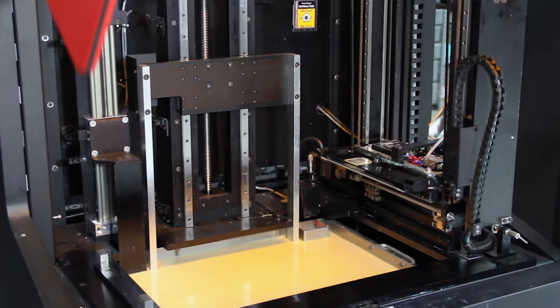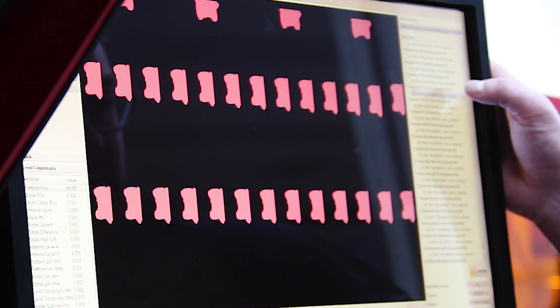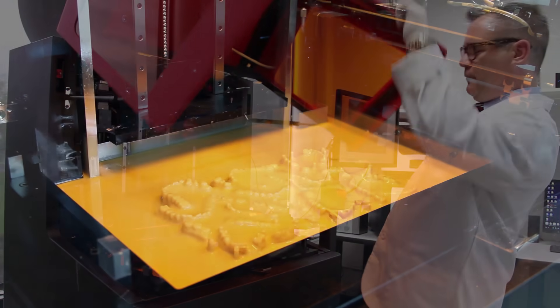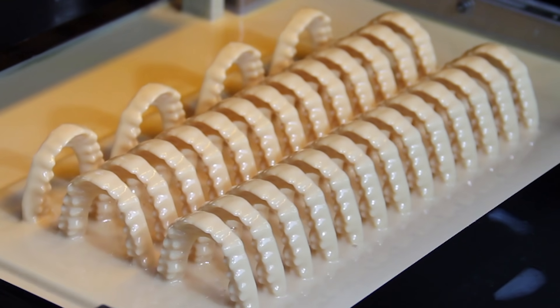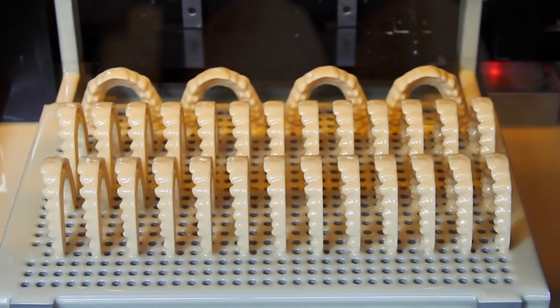The Vector3SP comes in two different versions. We have the Vector Ortho, which allows for XYZ resolution of about 100 microns. The Vector Ortho can print 15 to 20 models in underneath 2.5 hours. You can also print about 50 models in the vertical orientation for high-throughput aligner production.